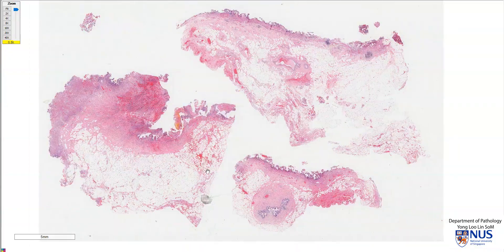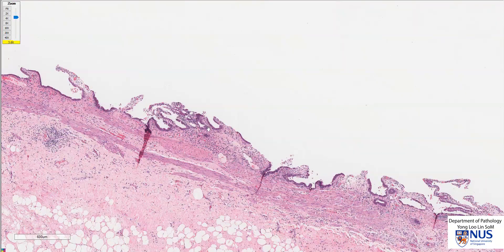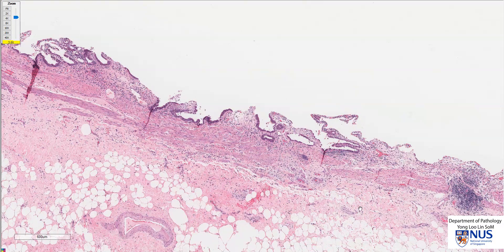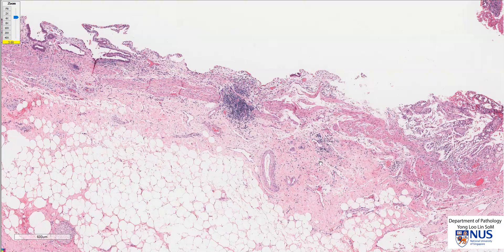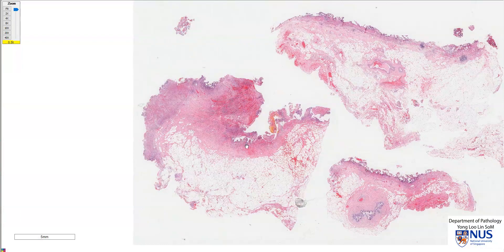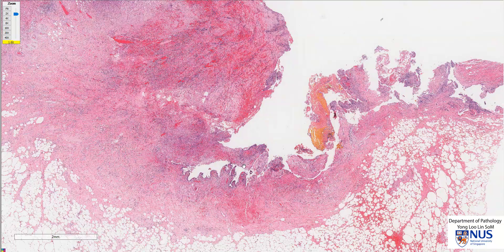In summary, this is an example of acute on chronic cholecystitis. We have features of chronic cholecystitis, including patchy chronic inflammatory infiltrates in the gallbladder mucosa and wall, and also some subserosal fibrosis. And we have the features of acute cholecystitis, including mucosal ulceration, congestion of the gallbladder wall, hemorrhage, and mural edema. Thank you.